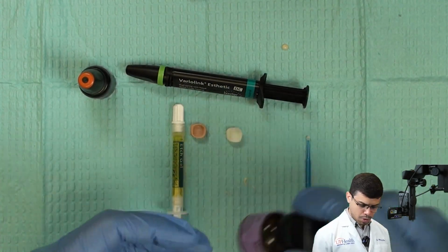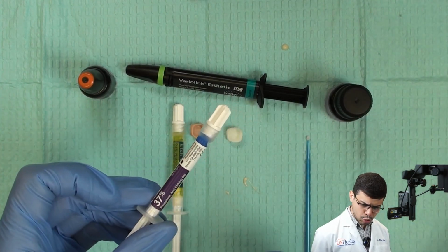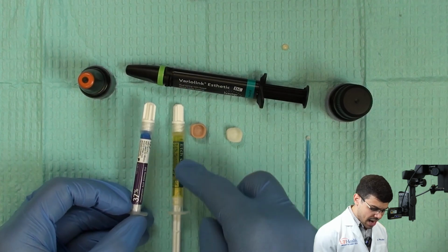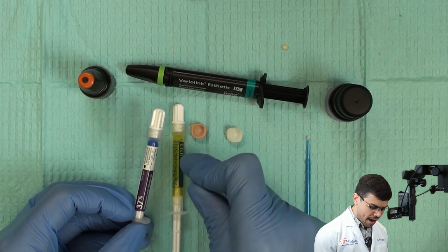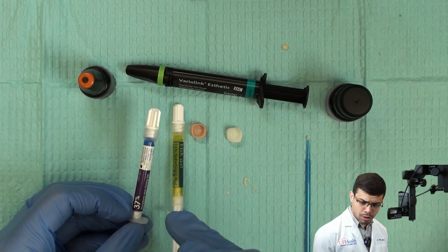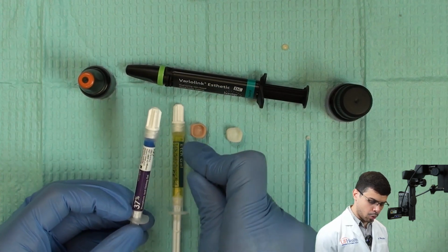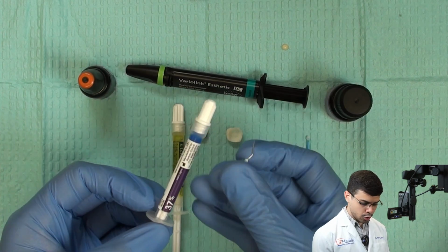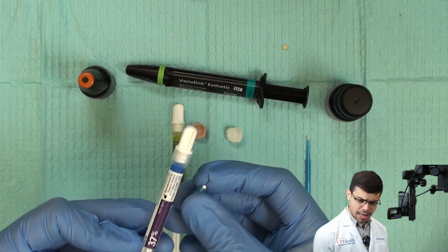Okay, so I have the Monobond Plus here. Also, I'll have a phosphoric acid here to use on the tooth. Pay attention, it's different: phosphoric acid and hydrofluoric acid. Hydrofluoric acid, never in the mouth, okay? If you have hydrofluoric acid in the mouth, you might cause a severe burn on your patient. I'm telling you, severe. You also need to wear gloves all the time because this is a very, very strong acid. Phosphoric acid, you also have to be cautious with, but it's less strong.